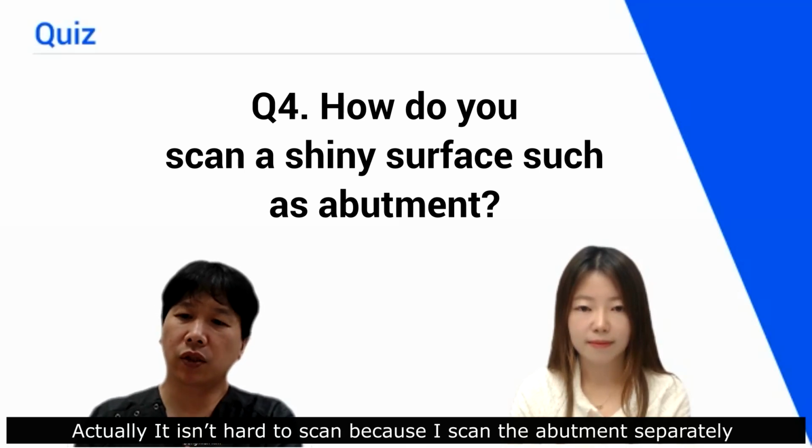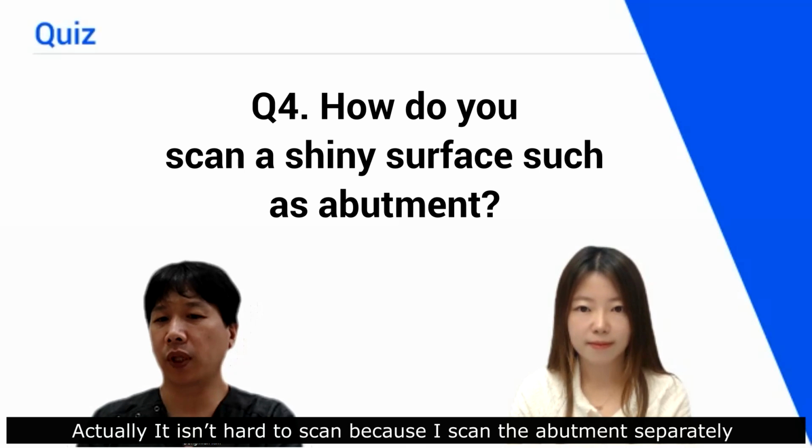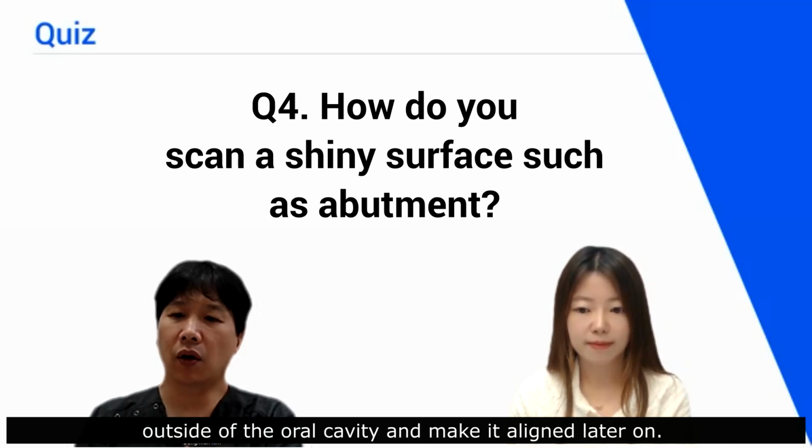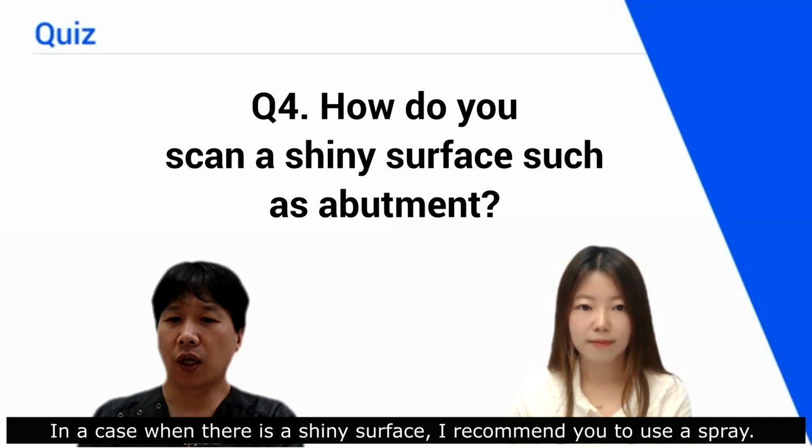Actually, it isn't hard to scan because I scan the abutment separately outside of the oral cavity and make it aligned later on. In a case when there is a shiny surface, I recommend you to use a scan spray.